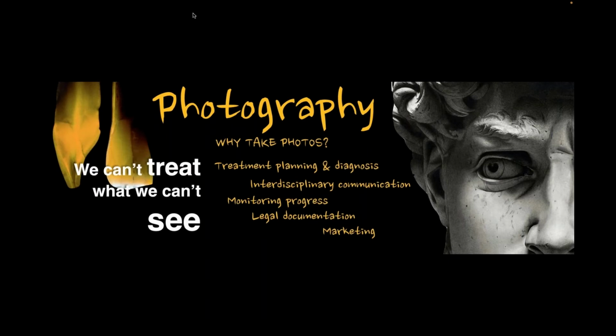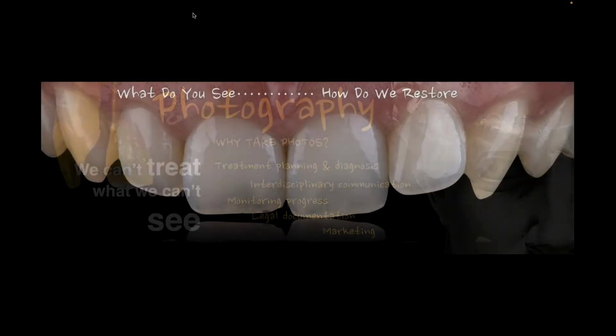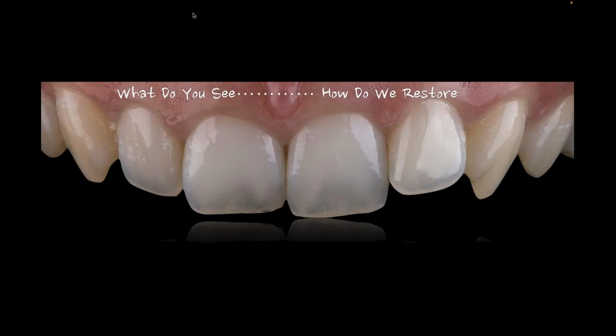I can't tell you how many cases I do that I did an upper arch, 5-6 years ago, and now I'm doing a lower arch, and I have the documentation of everything I did. And obviously, if there's ever an issue or a problem, having that documentation is important. And then obviously marketing, which everybody kind of really has as their focus. But my focus is, what do we see when we look at nature? And understanding that aspect of the chromas and the values and the translucencies and the halos and mamelons and the surface texture and the luster and all the things that kind of fit in there become really important for us to start communicating or be better communicators in the shade taking process.